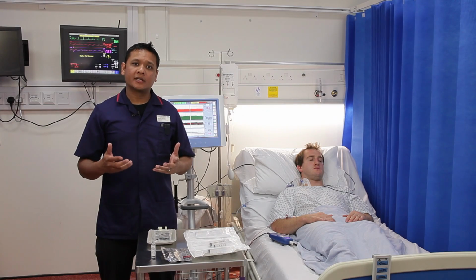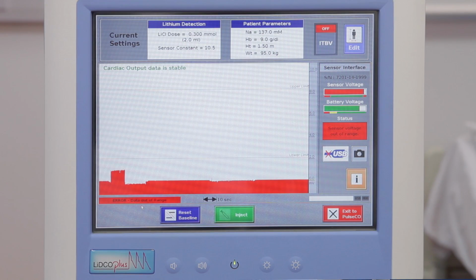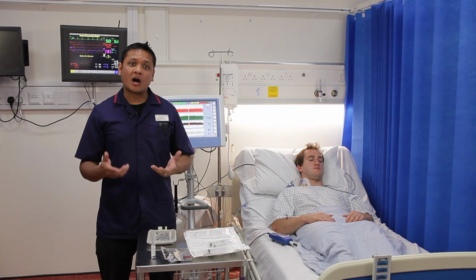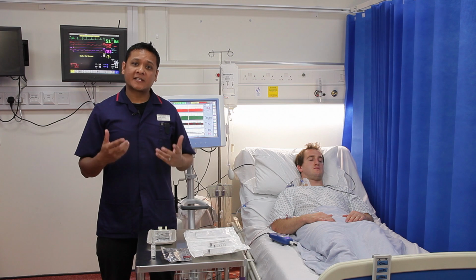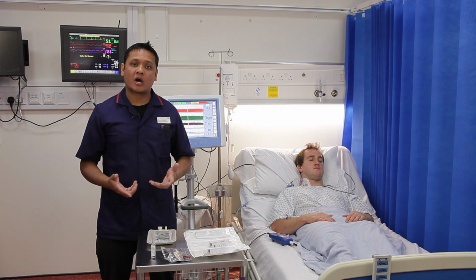When calibrating, if you see the sensor voltage is out of range and displays as a red bar rather than a green bar, that means you need to check the sensor and the interface cable. Make sure there are no bubbles in the sensor itself. If there are, flush the sensor via the transducer. Check the sensor interface cable and make sure that the connection to the sensor is dry.